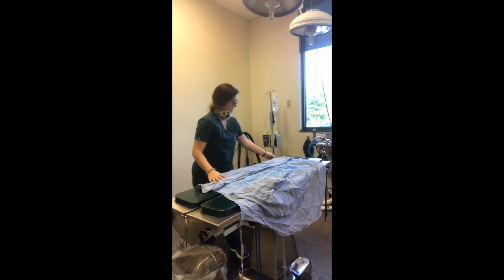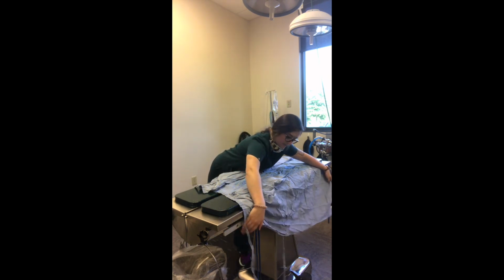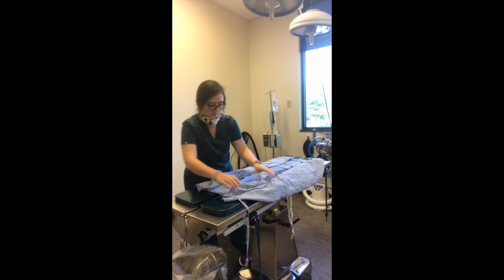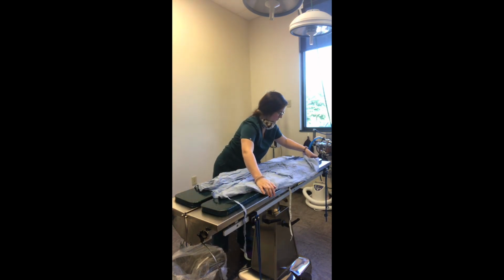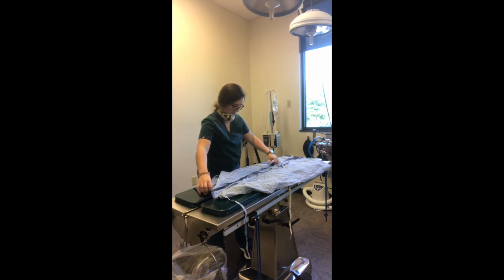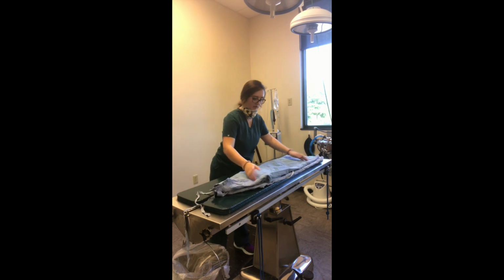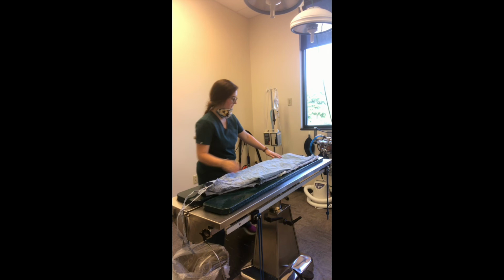Fold over. After folding the edges in, we're going to fold it in half lengthwise, making sure the neckties are out.